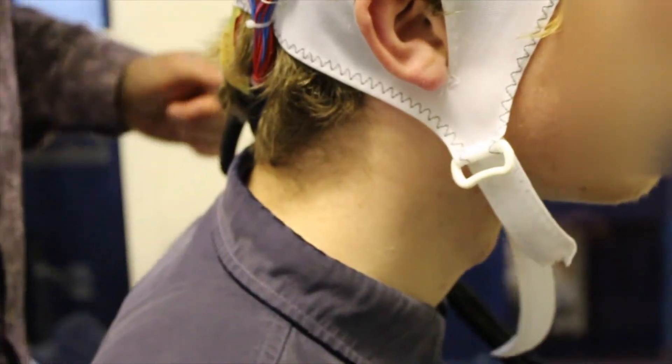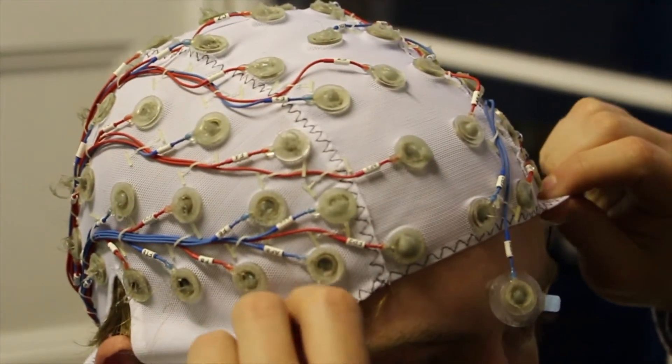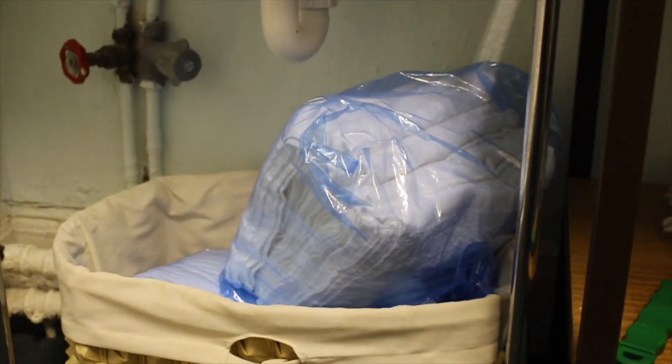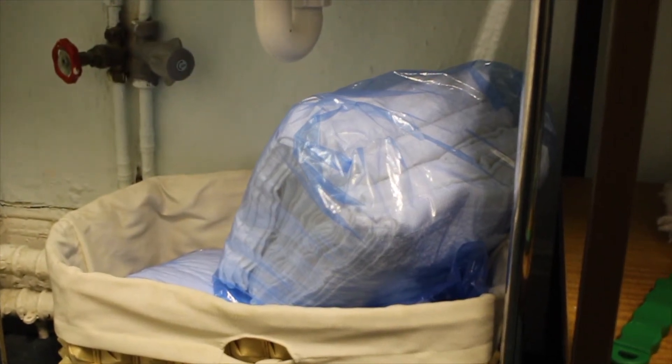Gently lift the cap away from the scalp. Facilities are available in the department for the participant to wash the gel out of their hair. Make sure you have some clean towels available. There should be someone in the lab in charge of retrieving clean towels from reception once a week.